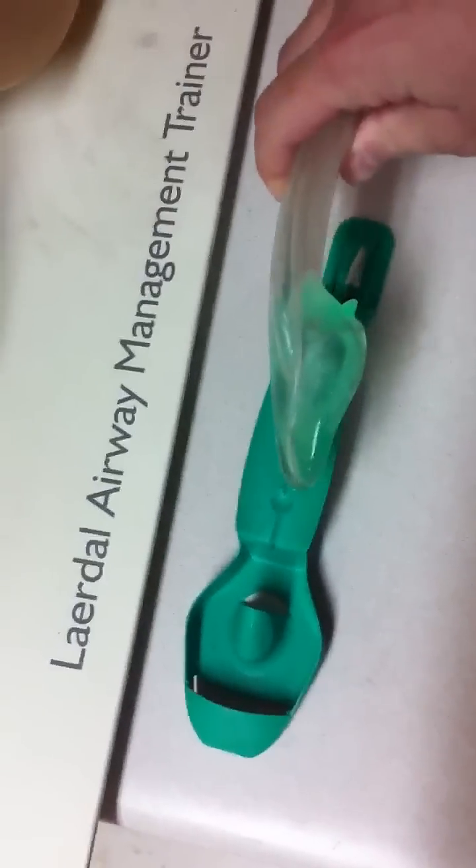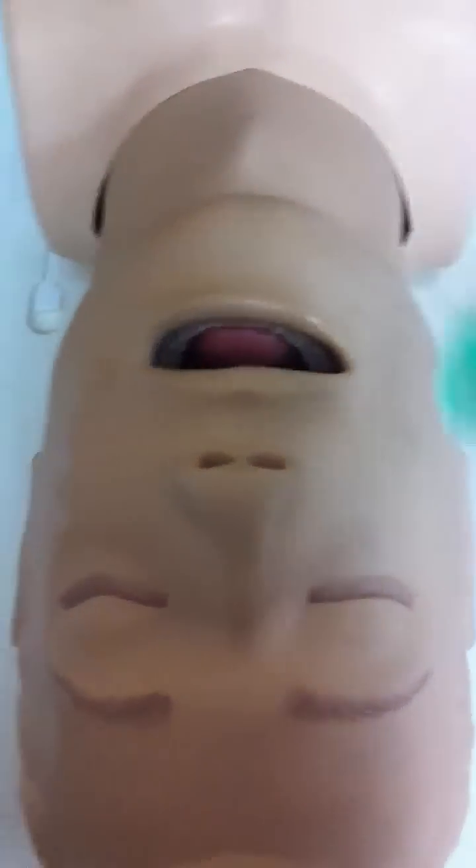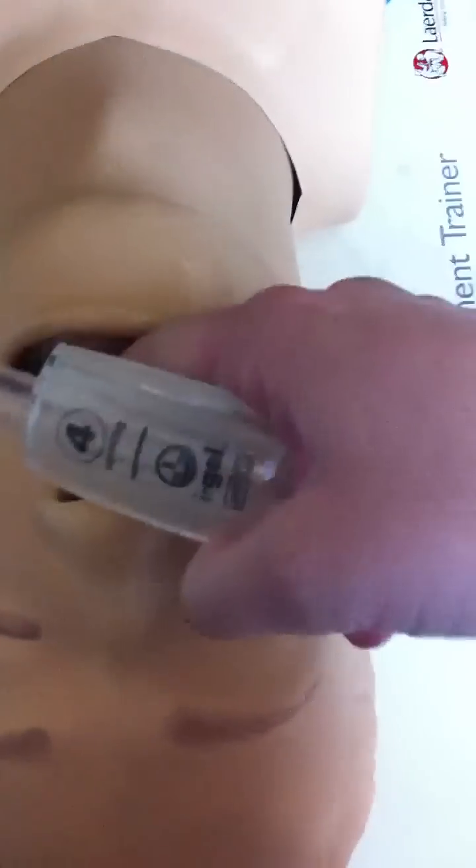The way they recommend inserting this airway is by putting a little bit of lubricant on the cuff, the tip, and this area here, and then you go to your airway. It is inserted similarly to the LMA; however, you do not have to stick your hand or fingers inside of the patient's airway.